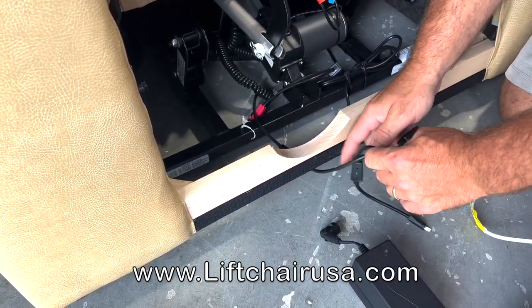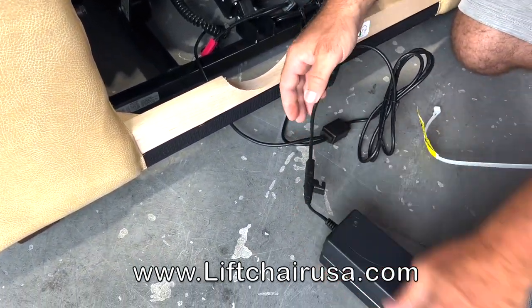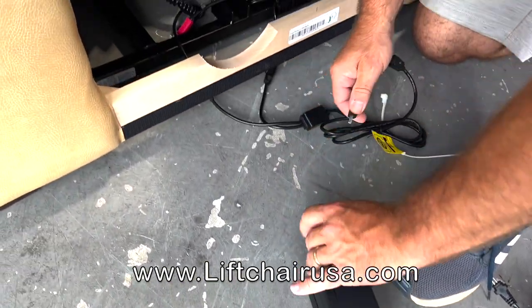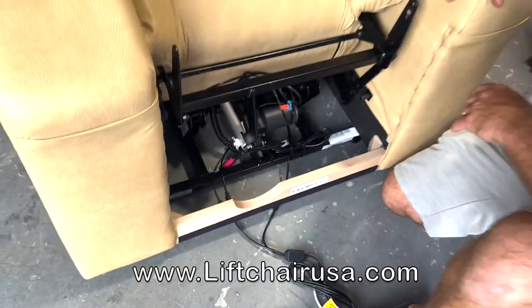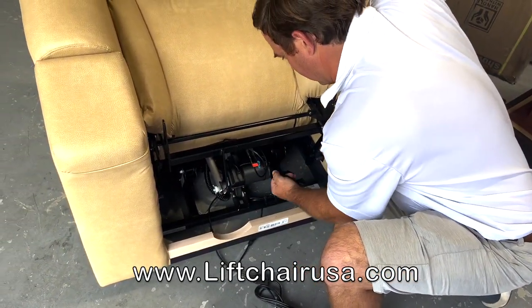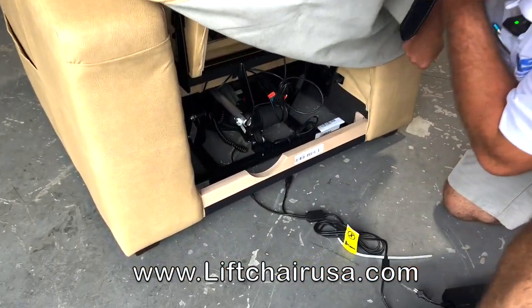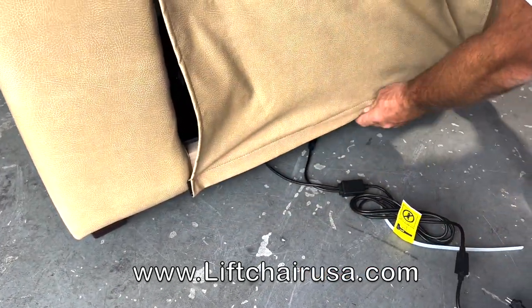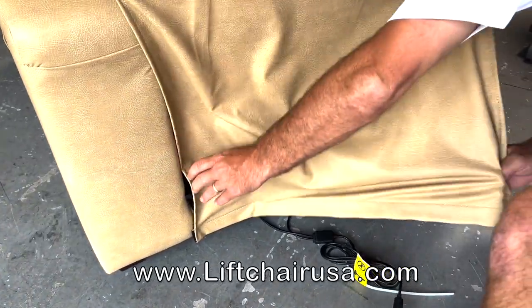You have a lot of cord. If you're close to a wall, just leave it. Plug that right in. And then this plugs into the wall. All right. So, these have to come up through here. There's Velcro. And you're just gonna come here and Velcro it across the back. Might have to readjust that every so often, or adjust it how you want it.